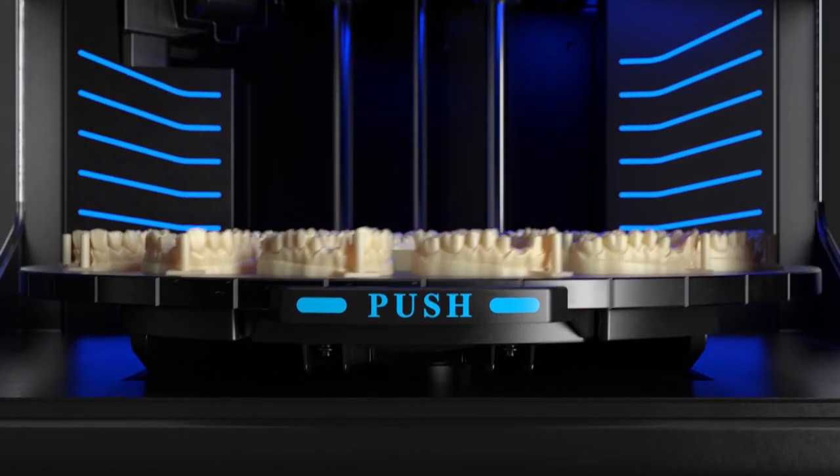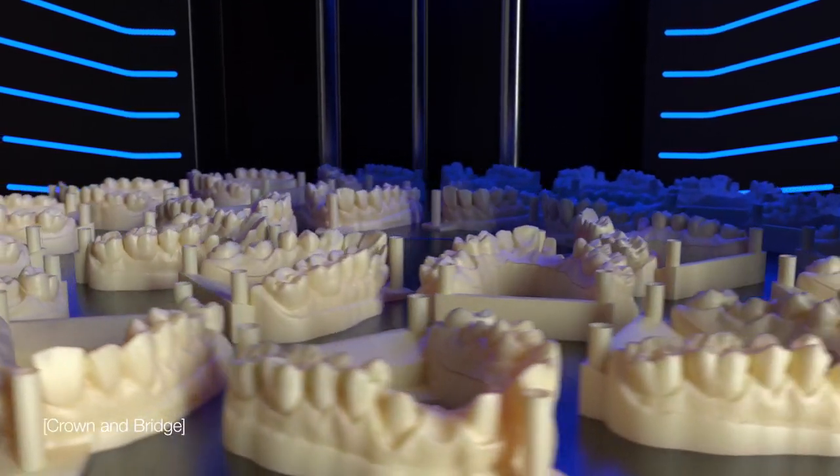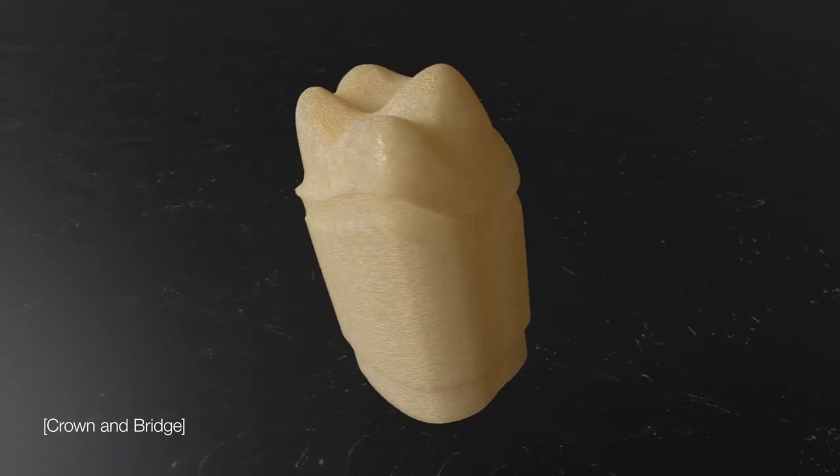Increase your lab capacity, eliminating the delays and inaccuracies of manual labor, with large volumes of exact crown and bridge models printed in high-resolution materials.